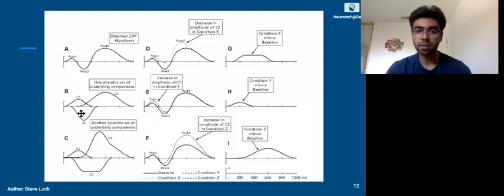But actually, according to the experiment that was done, there was only a change in the C1 component. And it was actually an increase in the C1 component, which caused this change in wave pattern. So just because you see a difference in two peaks doesn't mean they're different in two components. It can be the difference in just one component.